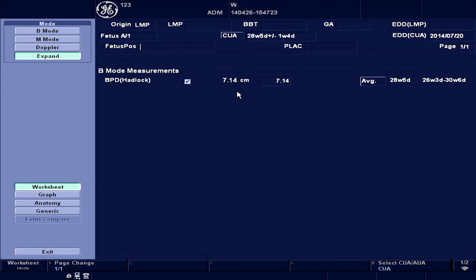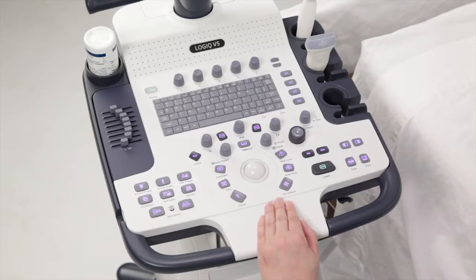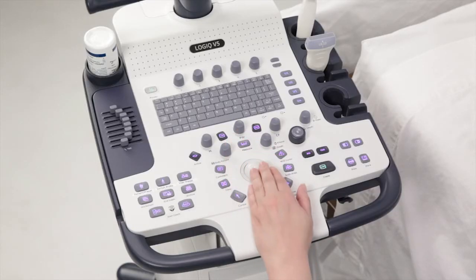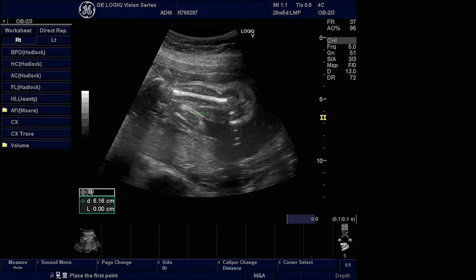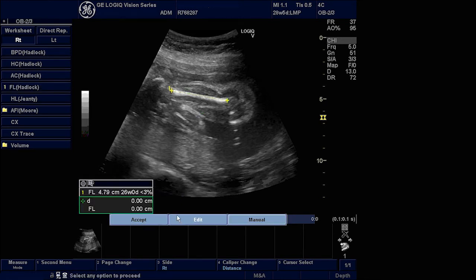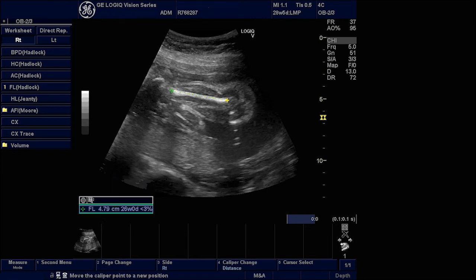Now we will walk through the steps to edit an auto-measurement. We will use the example of an FL measurement for editing. Once the image is on the screen, choose the FL measurement from the menu. As earlier, the tool will automatically place the calipers and obtain the measurement. To edit this measurement suggested by the tool, select the Edit option displayed on the screen.